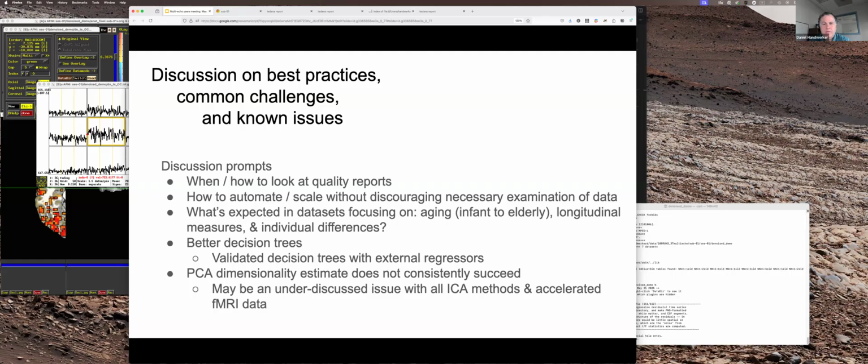Yeah, the new fit to the rejected regressors was added just a month ago, so it's in version 25. Was that part of the release, or is it just in main? It's in the release. Okay.